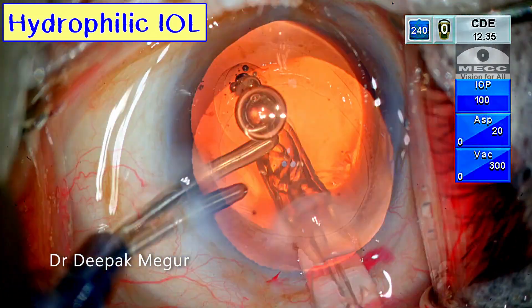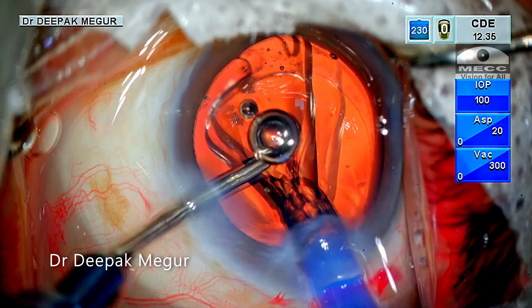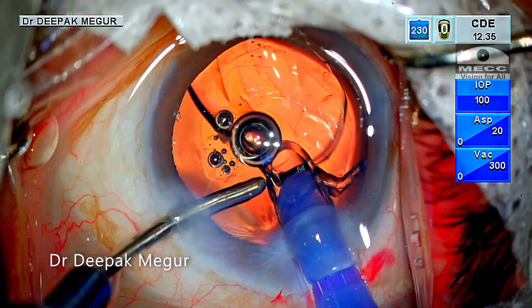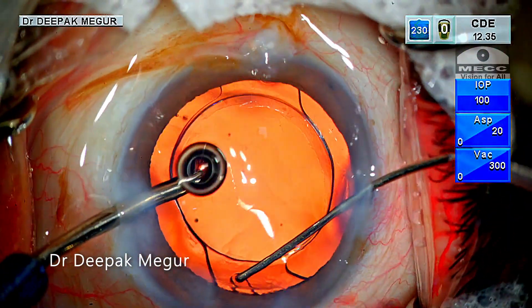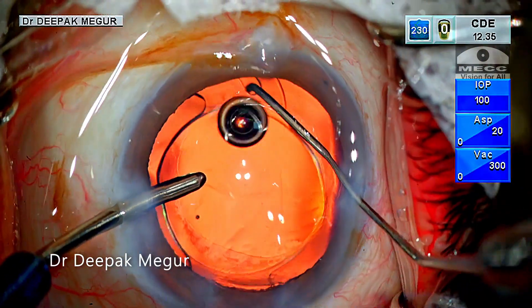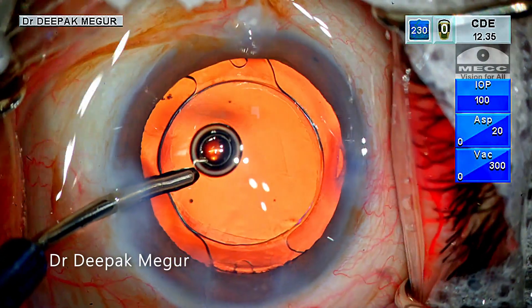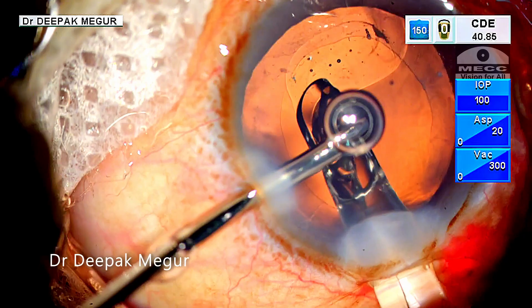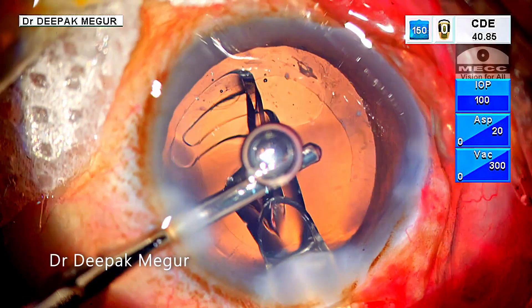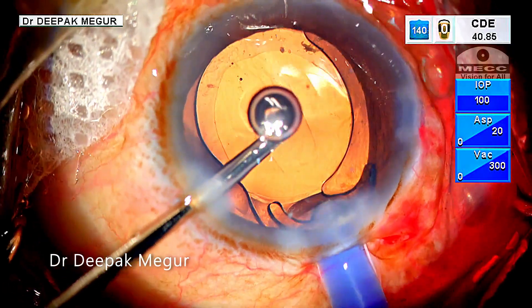This is a case where a hydrophilic intraocular lens is being implanted into the capsular bag. These lenses open up very gently and beautifully. If dialing of the lens is required, it is to be done through the opposite side port, and care needs to be taken that the chamber is always kept formed. One advantage of these hydrophilic lenses is that they come with a disposable injector system, which are all direct push systems.